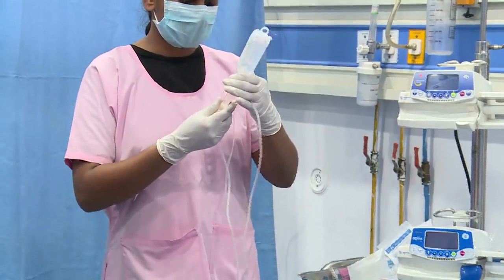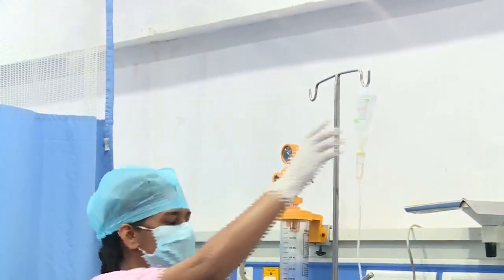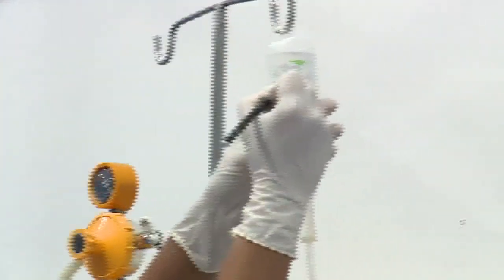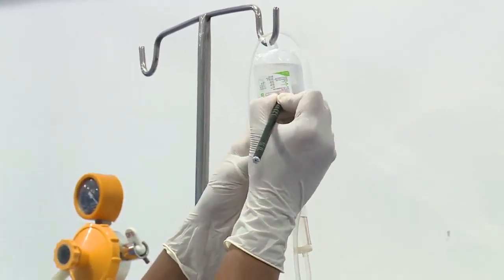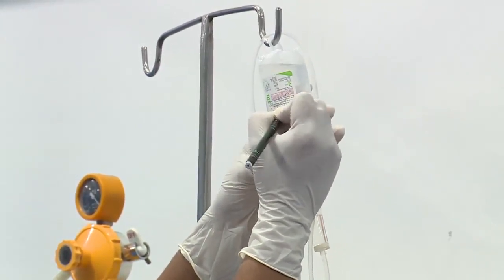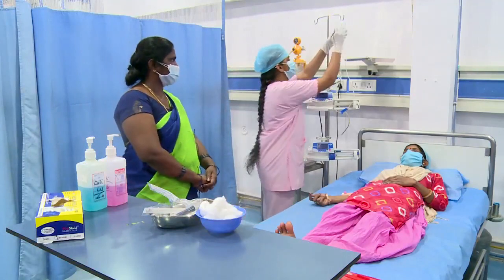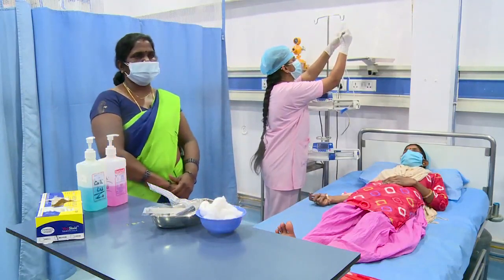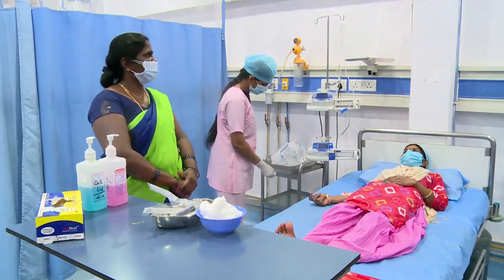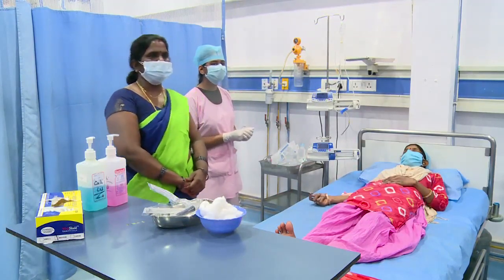Now she can connect the IV set. Now she can display the sticker: 10 ml of calcium gluconate, 90 ml of dextrose over 30 minutes. She can write the time on the bottle, at 6 o'clock. It is very important so that anybody can come and see what is going on. It is easily visible to observe. The bottle label must be there for any inotropic drugs. Now we can start the drug.